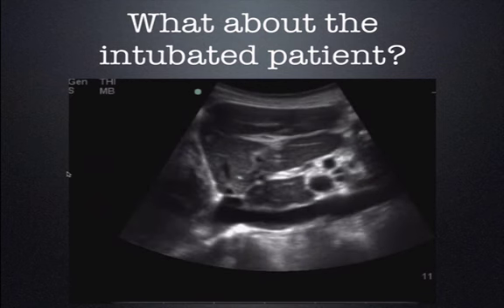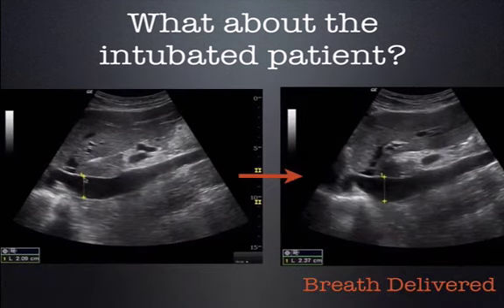In the case of positive pressure ventilation, the IVC is at its smallest diameter in exhalation. As a positive pressure breath is delivered, the liver and diaphragm descend down just as if you were breathing spontaneously, but that positive pressure here provides an impedance to forward flow. It's actually going to dilate the IVC. So effectively, your physiology is reversed.